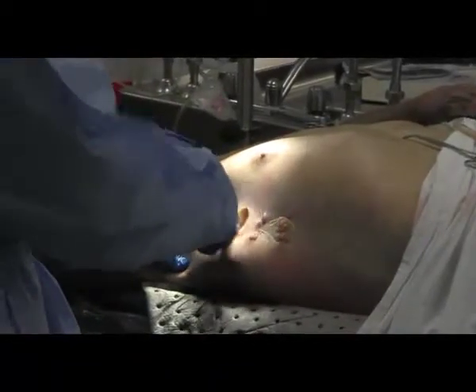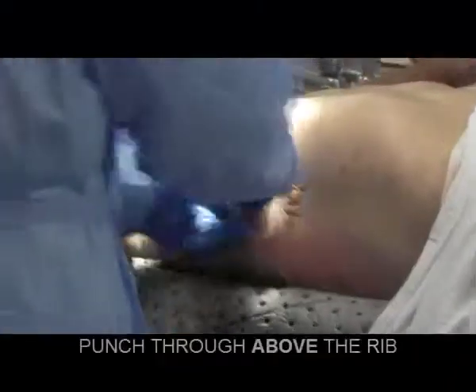Go ahead and take a scalpel. Dissect deep. Blunt dissection. Feel for the rib. Take the Kelly. Pop through the space.